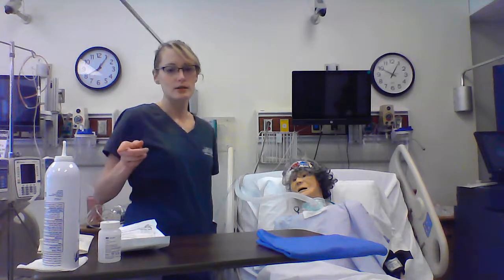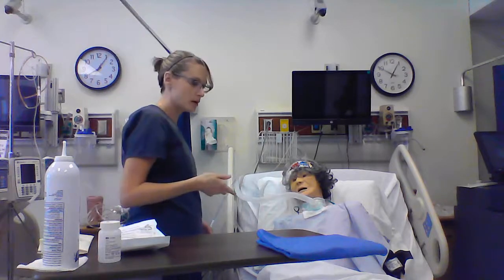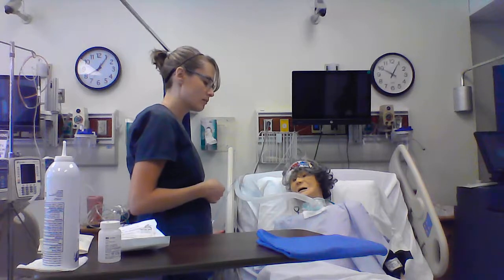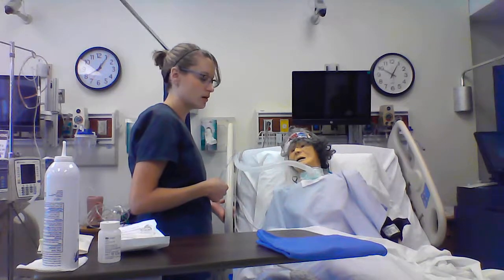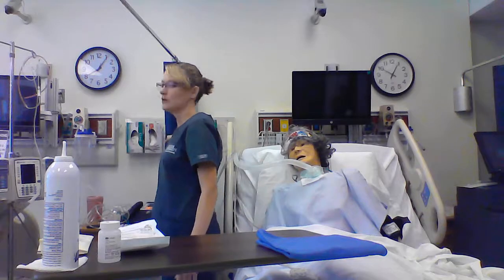So I go out and gather my supplies, come back into the room, let her know what we're going to be doing. So let her know what the procedure consists of. I'm going to raise her bed to a working height for me, so I'm not bending over to care for her. And then I also want to provide her with some patient privacy. So I would pull this curtain behind me.